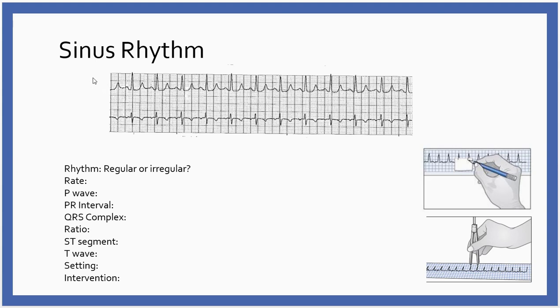With lead 2, I have a negative electrode up on my right shoulder, a ground on my left shoulder, and then the positive electrode is down on the left anterior side of the chest, a little bit lower down in the chest. And so the electrical vectors coming from the heart are moving towards that positive electrode. That's why these complexes are upright.